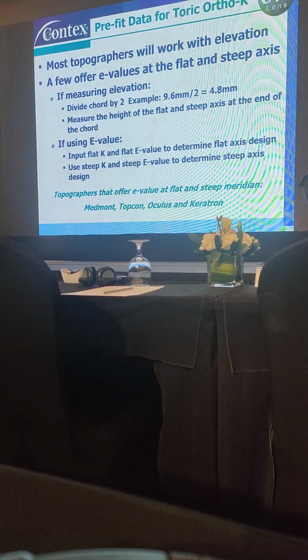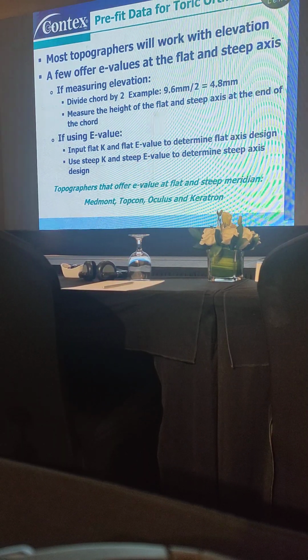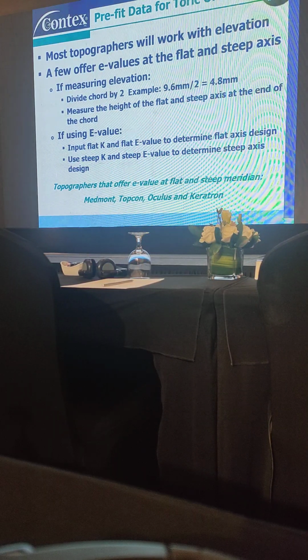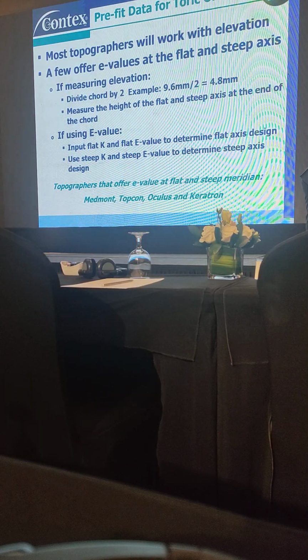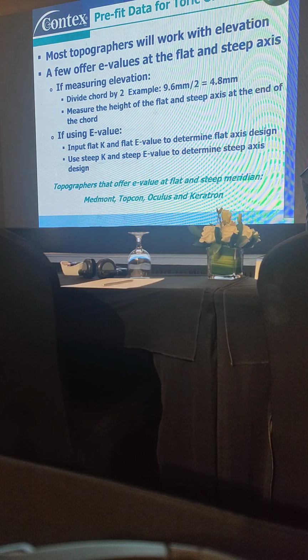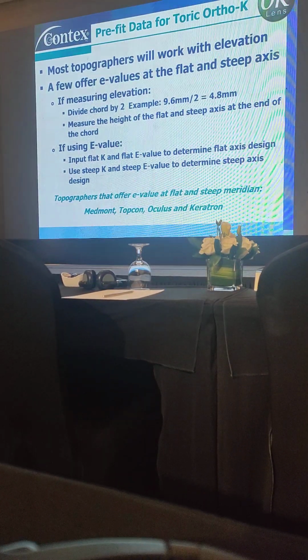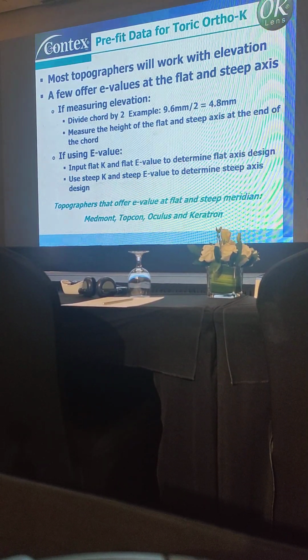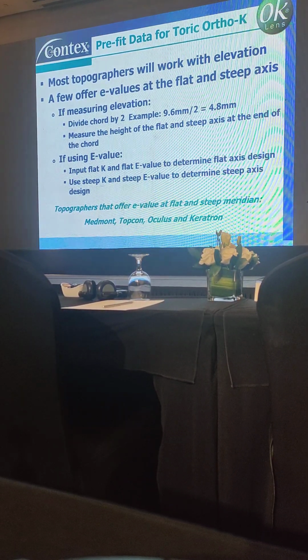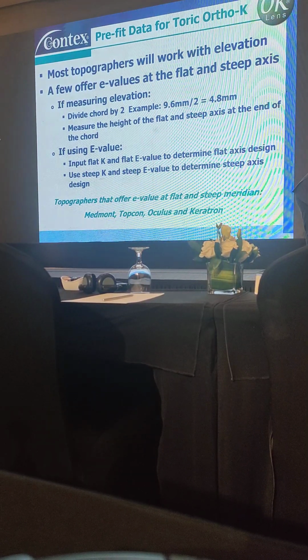When doctors email us the Medmont file, someone here imports it into our Medmont and pulls the exact elevations for me at each quadrant, and then we input that into our software and design the lenses from that. 8 millimeter elevations and 8 millimeter E values don't mean a lot to an orthokeratologist. Does that make sense? Because you're fitting bigger lenses, you really need the real data.